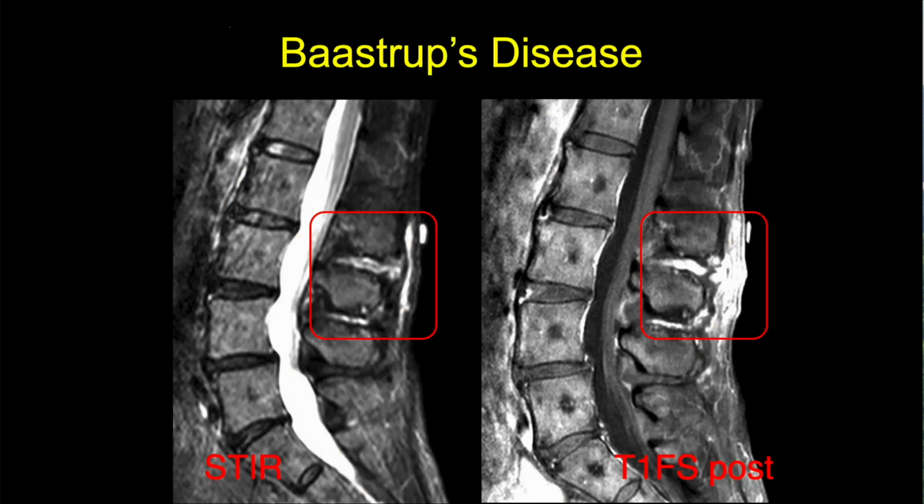Now, when you see people at this age, for ankylosing spondylitis, obviously they don't get any difference, but the stresses are there. Now, this patient gets stressed, especially with degenerative disease.